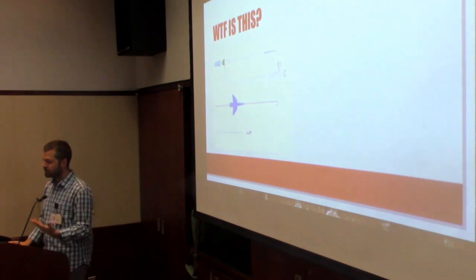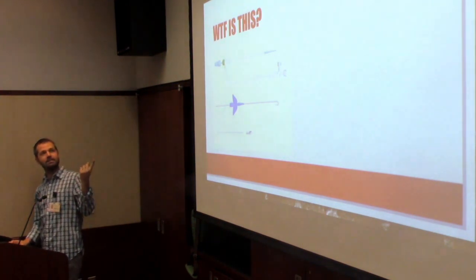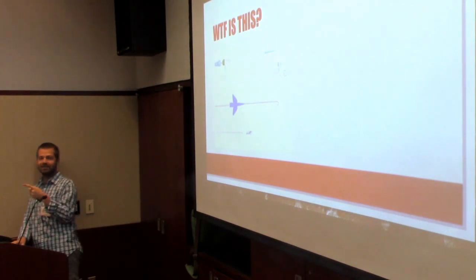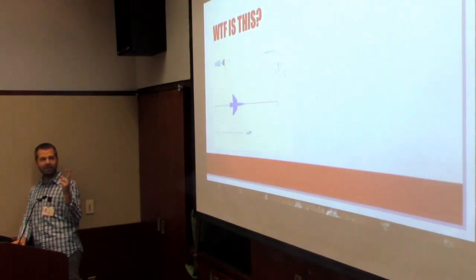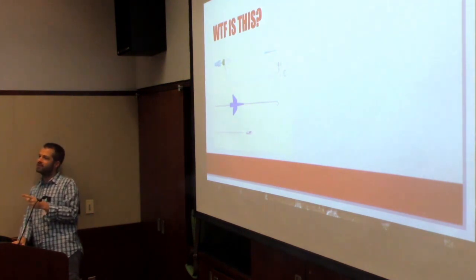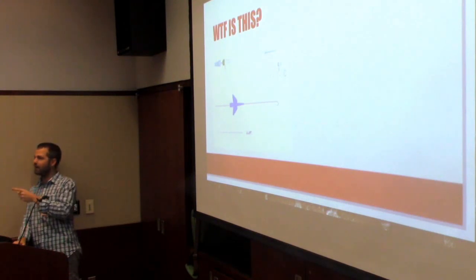So, knowing your tools. Can anybody tell me what this guy is? Someone says cordis. Any other answers? This drove me crazy when I was an intern. Go get the cordis. And there's no cordis. Nothing says cordis in the supply closet. And then in the ICU at Cornell they say, go get the arrow. And you can't find anything with the word arrow on it that isn't like an ABG arterial line stick kit.